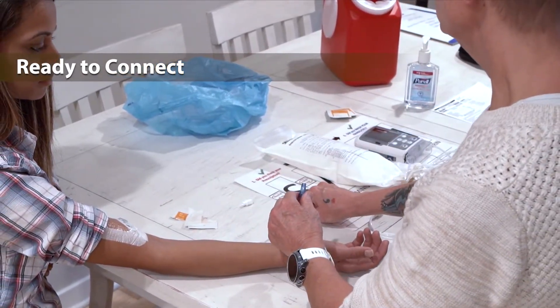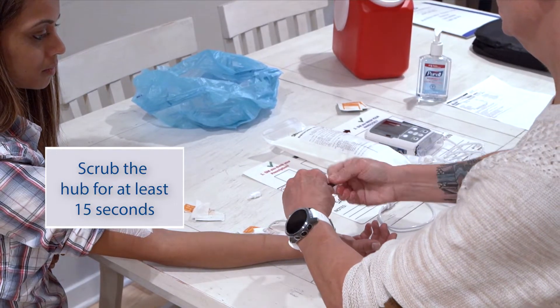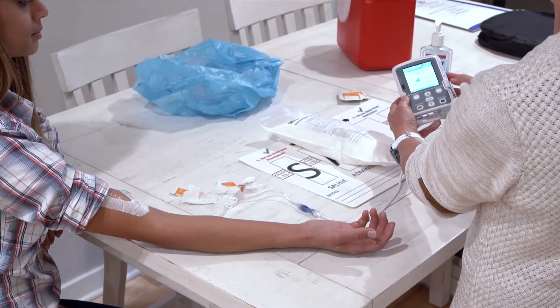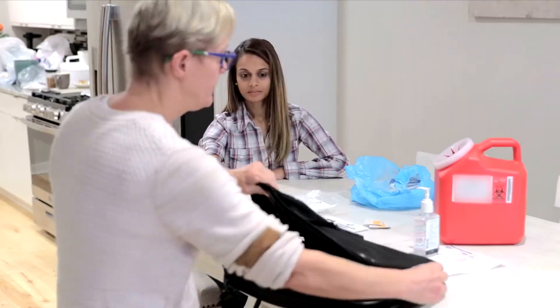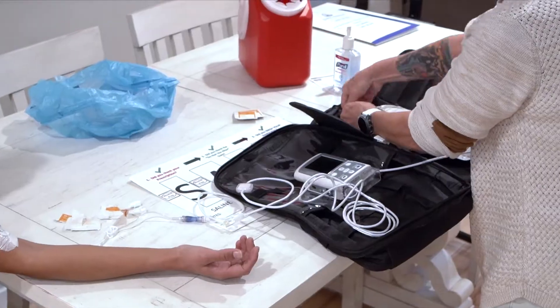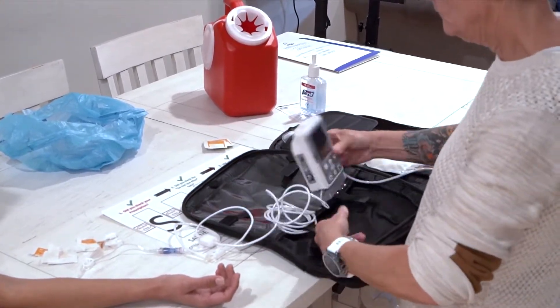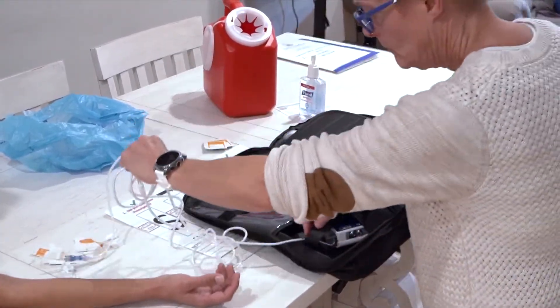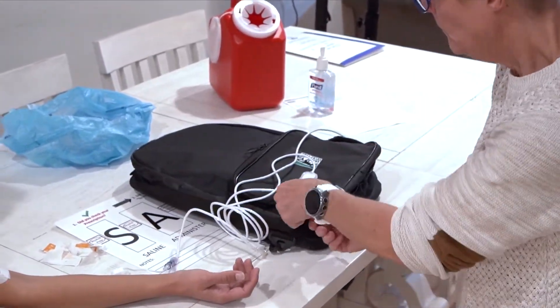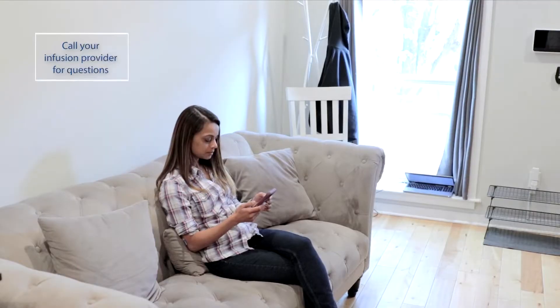Now you are ready to connect. Scrub the hub again. Connect the IV tubing to your line. On the pump, push the start button and select yes to start the pump. There should be a green running message so that you know the infusion has begun. Place the pump and the TPN bag into your carrier bag. Wash your hands one final time. You have now completed starting your TPN therapy. If you have any problems with your TPN infusion, call your home infusion provider.